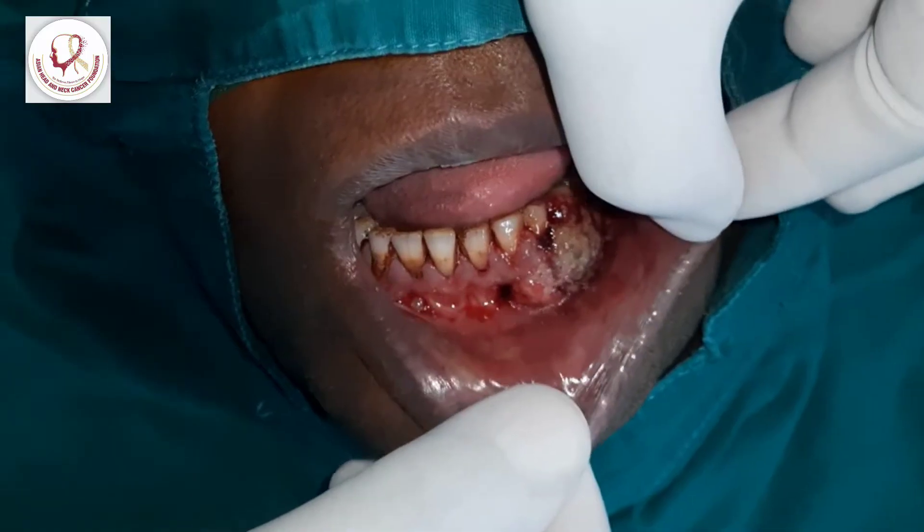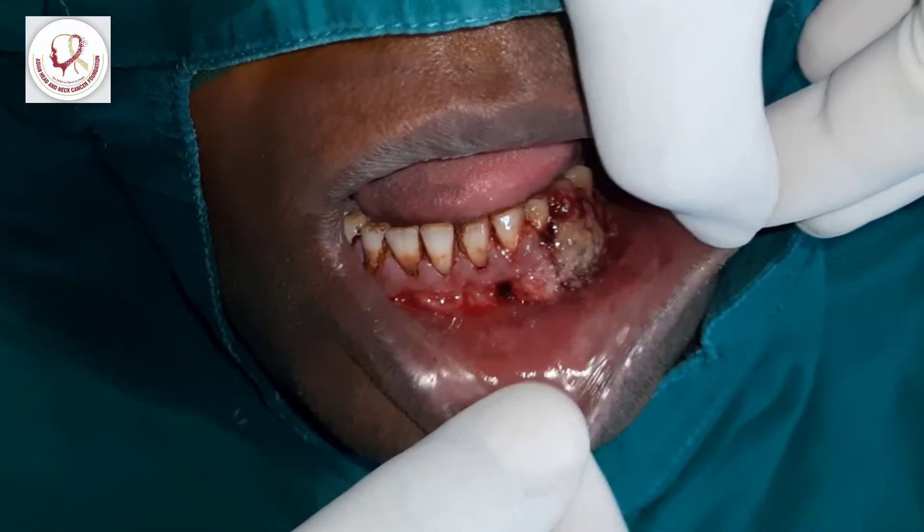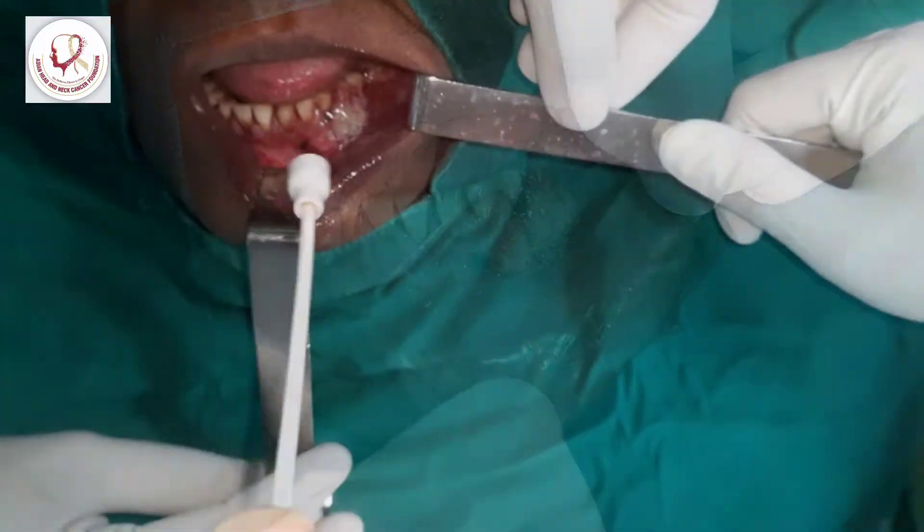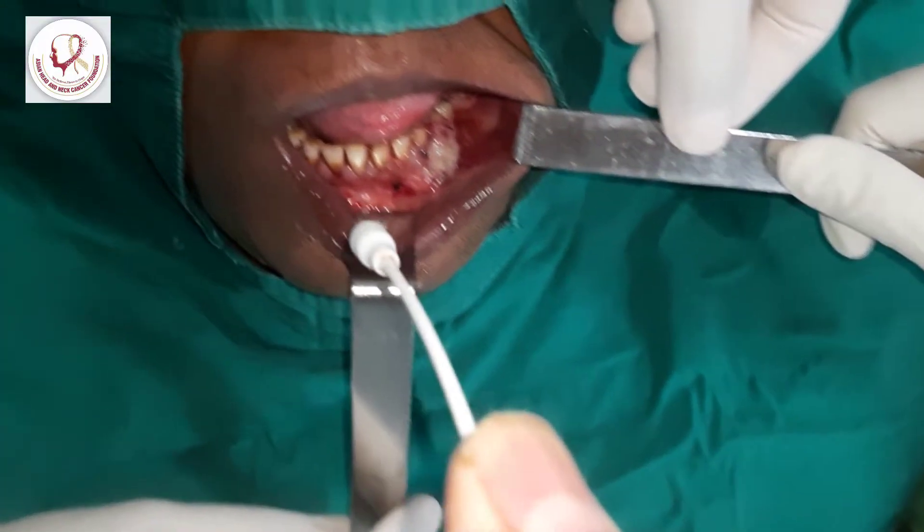This is a lesion of the lower alveolus. We are going to demonstrate the biopsy today. This is local spray we are putting there.